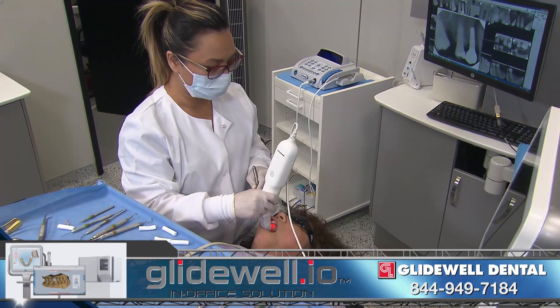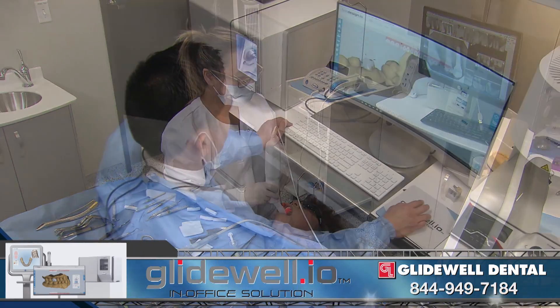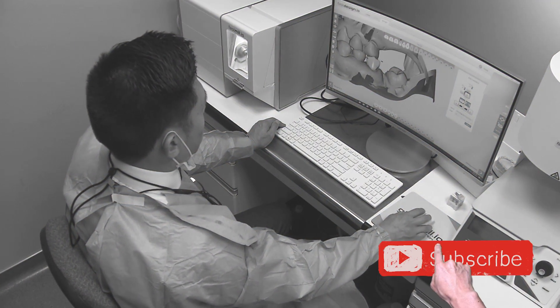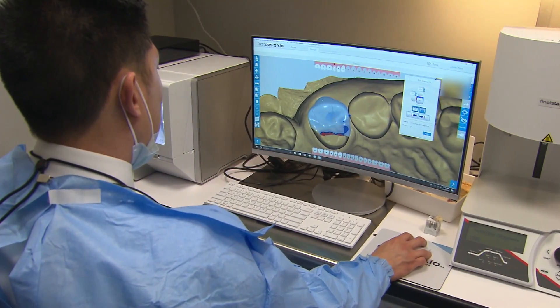My assistant Vera is capturing the digital impression of the area using the iTero Element scanner. Once the prep, opposing, and bite registration are scanned, the data is transferred to the FAST Design software that proposes an aesthetic and functional design for our onlay.